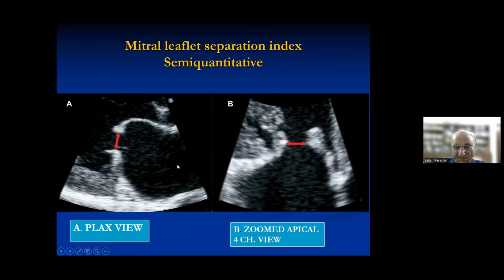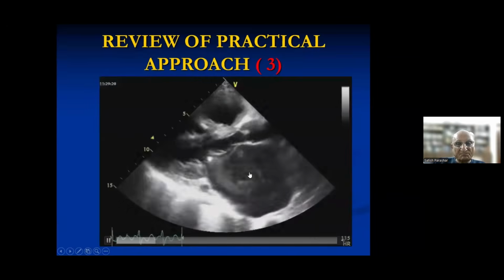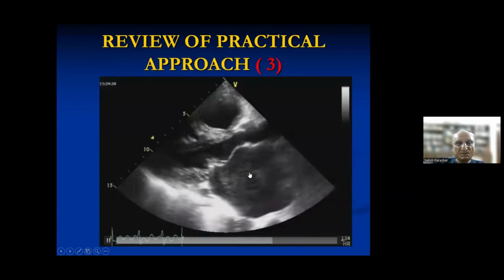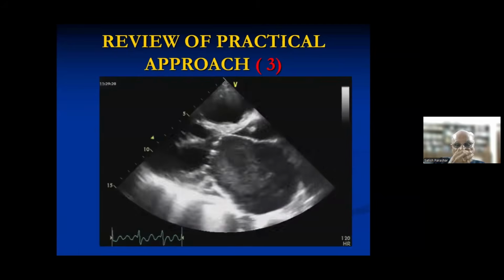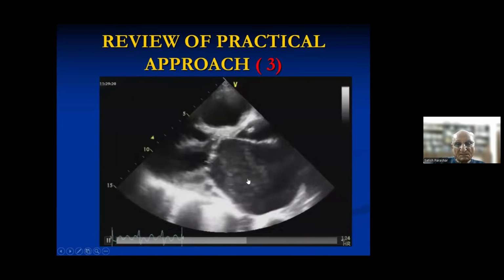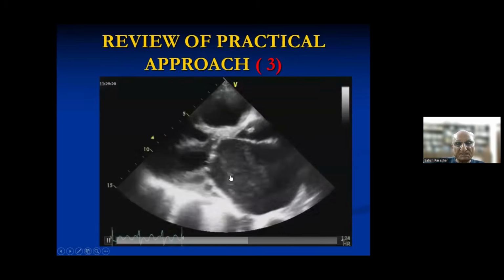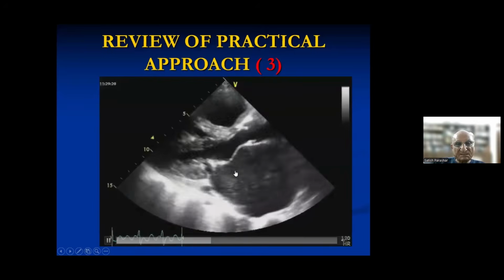So to revise, I have not told you transesophageal, but to revise, you start with a parasternal long axis view. You see three things in this. Number one, you see the size of the chambers. You see the spontaneous contrast echo. You see the pattern of opening of the anterior mitral leaflet. You can see the patient is in atrial fibrillation.